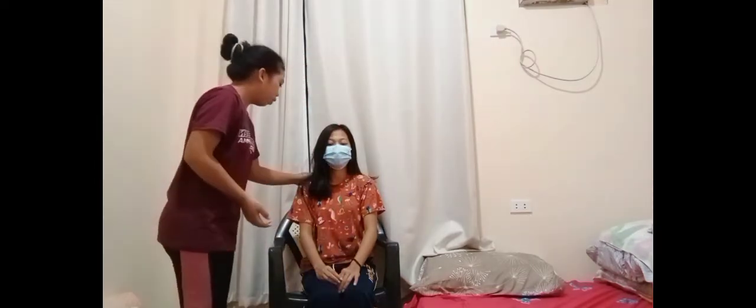We need to move aside, ma'am, from the chair. Can you feel the chair, ma'am? Yes. We need to sit down slowly. Next, flex your knees and hips while assisting the patient into the wheelchair or chair. Assist the patient's alignment and make the patient comfortable. Are you comfortable with this, ma'am? Yes. Okay, that's it for moving from bed to a chair.